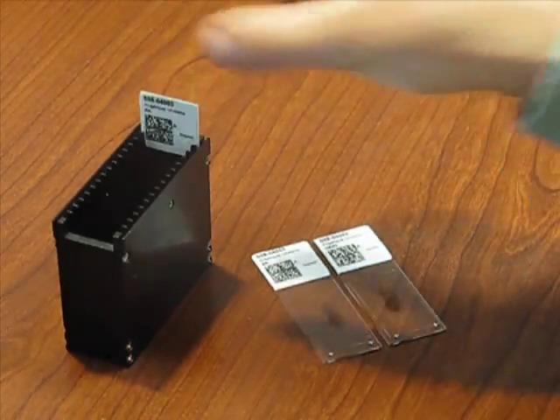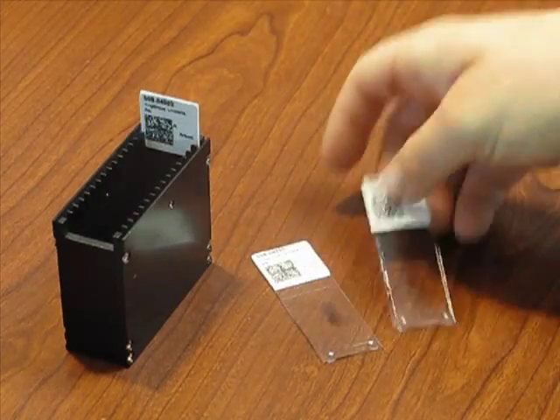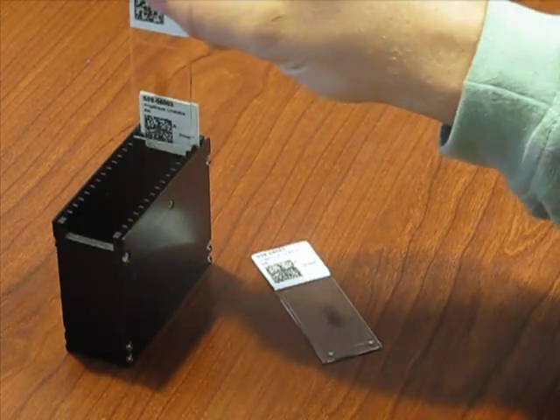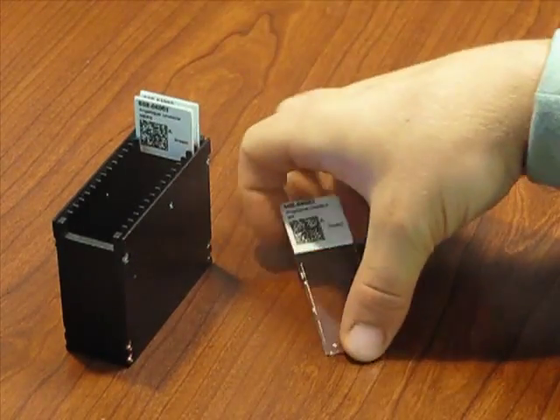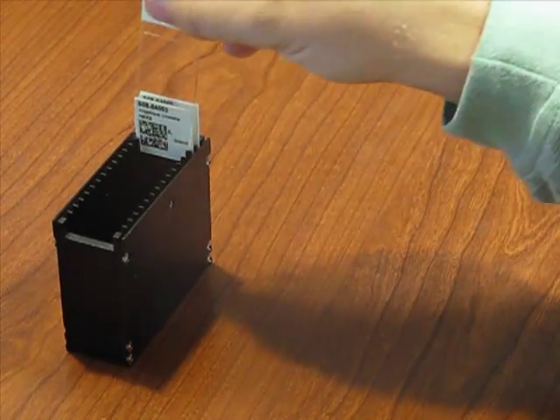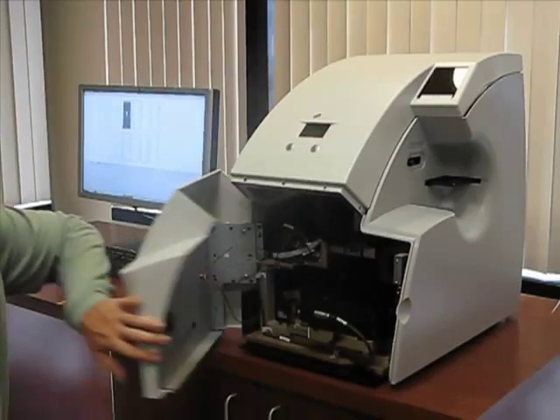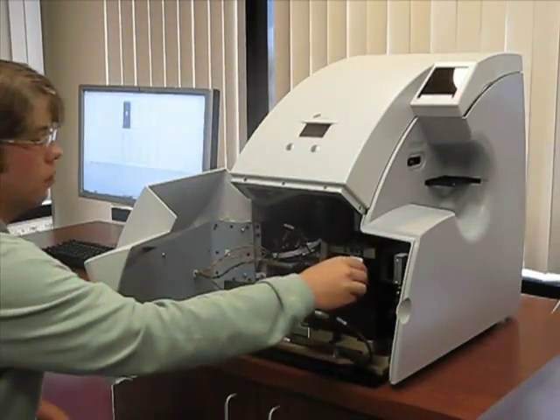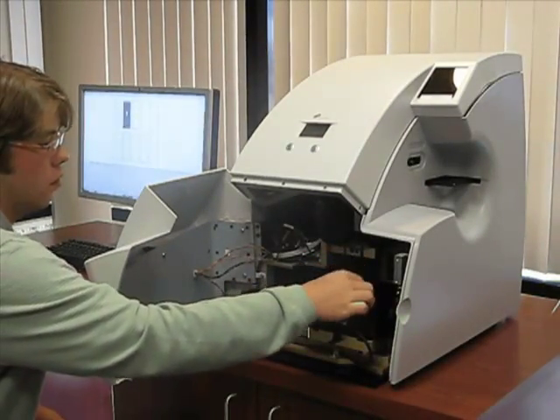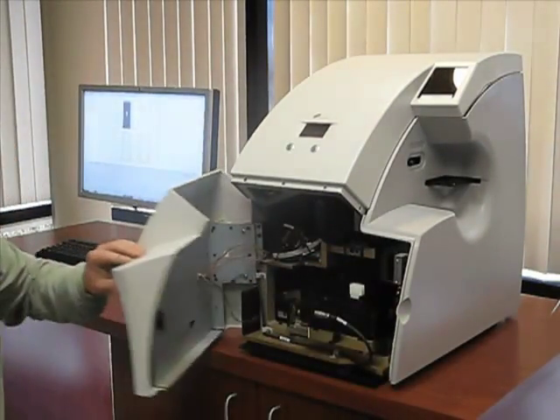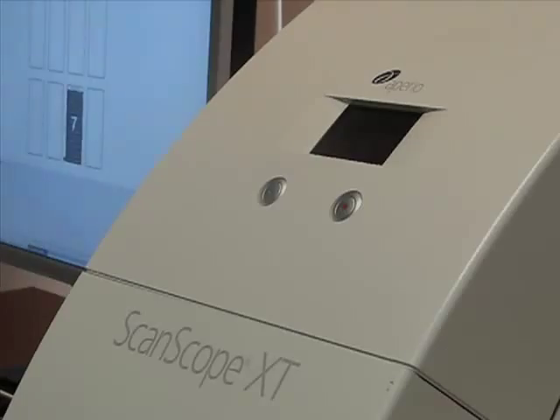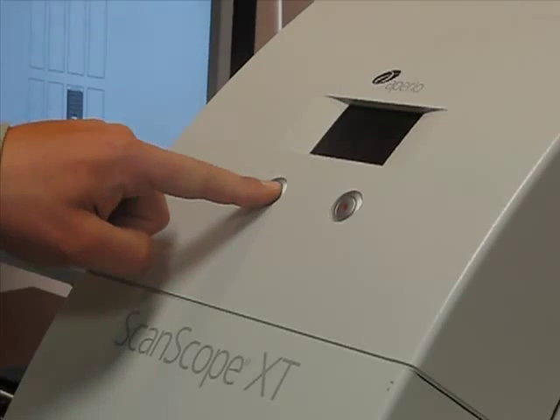Aperio provides high quality and high throughput slide scanning with walk-away automation. You can use barcodes and integrate Aperio's digital pathology system to your LAS to completely automate your data entry.